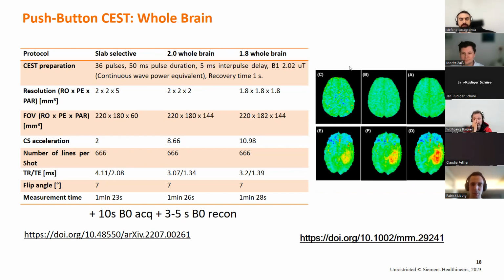And you can also specify in the evaluation which contrast you want to look at, so if you want to look at a MTR or so forth, basically where the evaluation is going to take place.